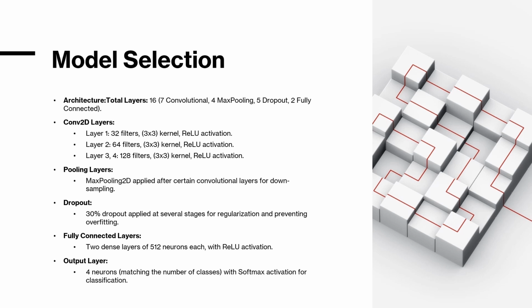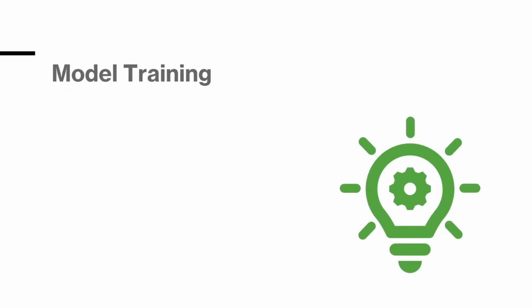The output layer consists of 4 neurons corresponding to the number of tumor classes, with a softmax activation function for multi-class classification.